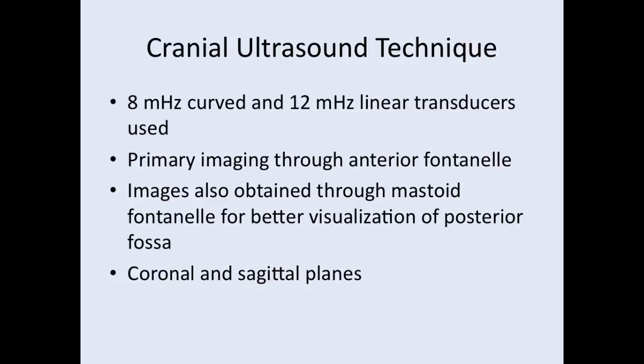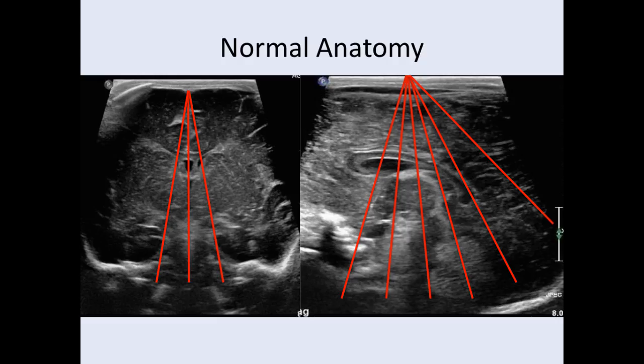We obtain images in both coronal and sagittal planes. Here is an example of the standard still images that you would obtain for a cranial ultrasound in both the sagittal and coronal planes. We also obtain cine images in both planes, which encompass these same positions, but some institutions only rely on still images, so these are the standard sets of still images that you need to obtain.